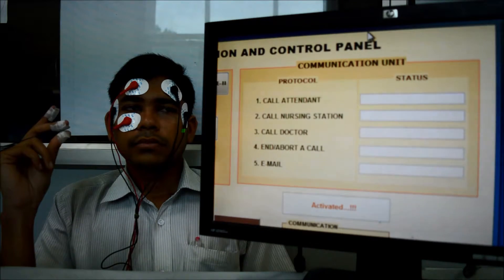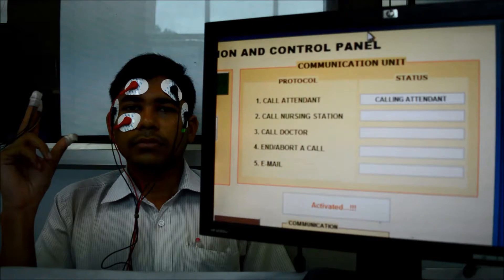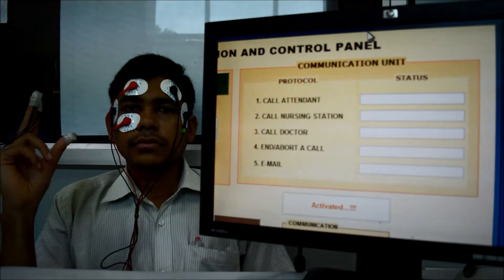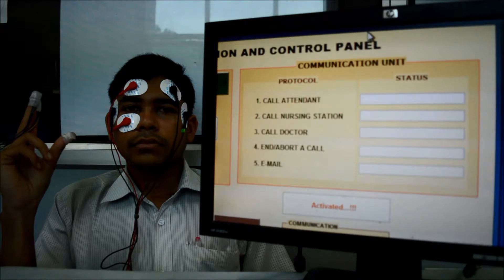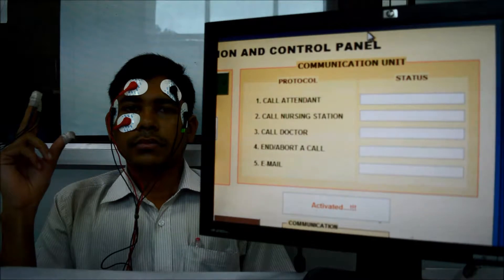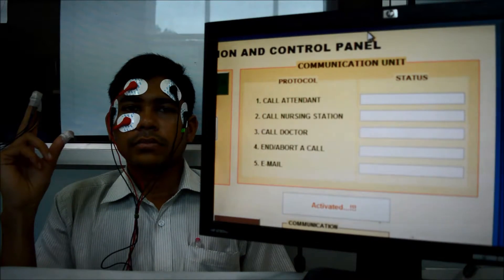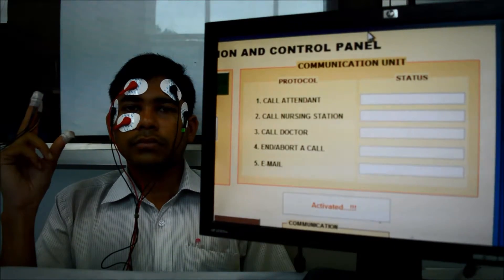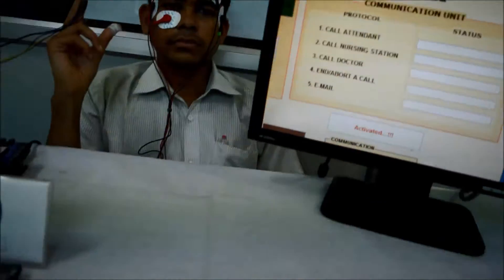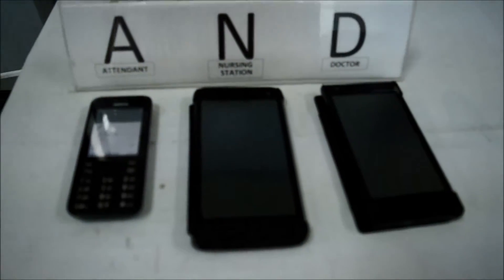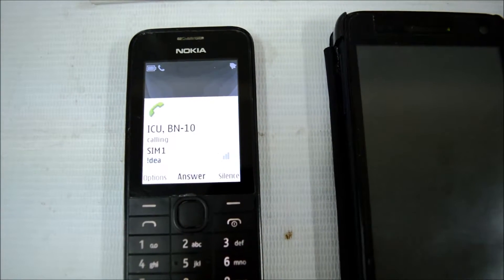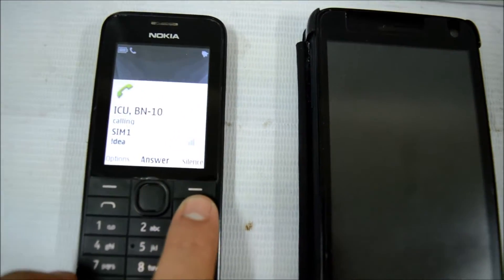Call attendant. The call to the attendant has been initiated. Here you can see the attendant mobile number is ringing. You can see it is saved as ICU bed number ten.